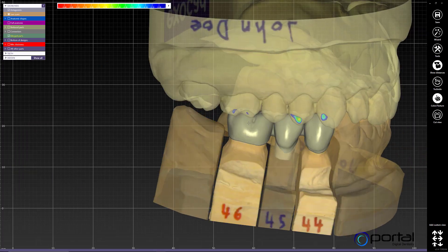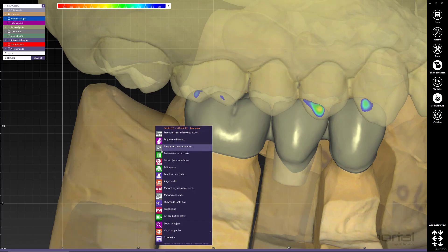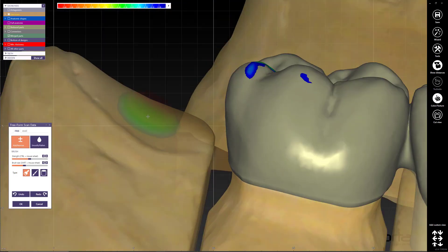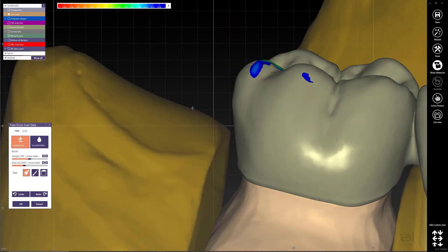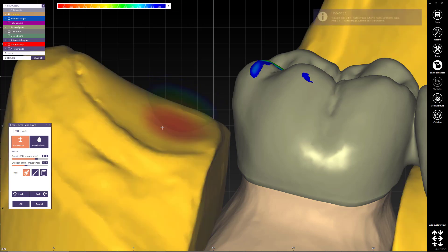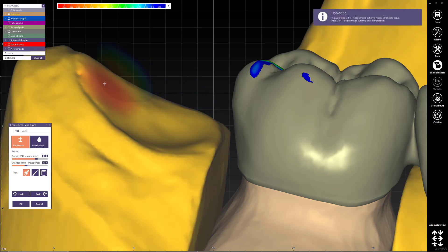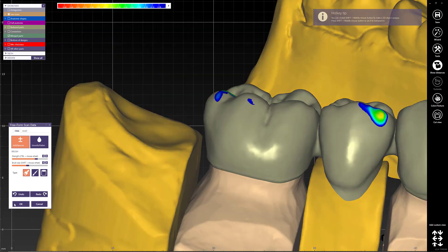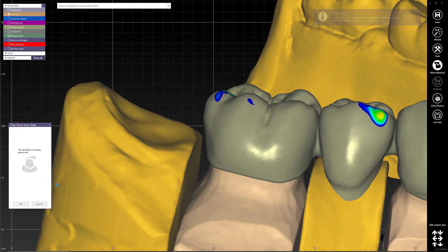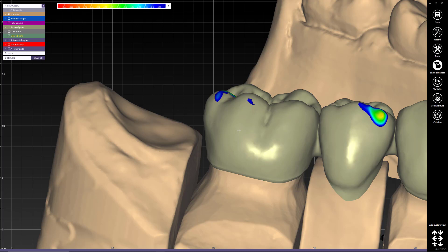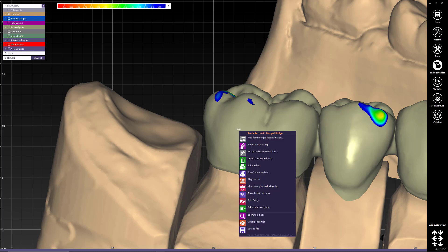Now I want to add a molar here. I can take the time to promote free-form to scan data and make further changes if needed — for example, to create a deeper sulcus. But let's pretend this is perfect. Now I can right-click on my merged bridge and go into free-form.